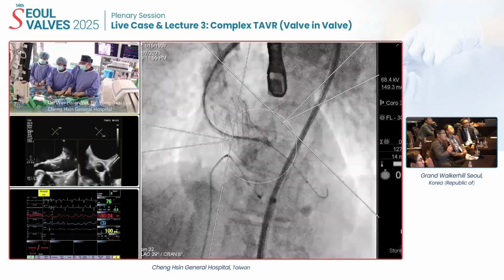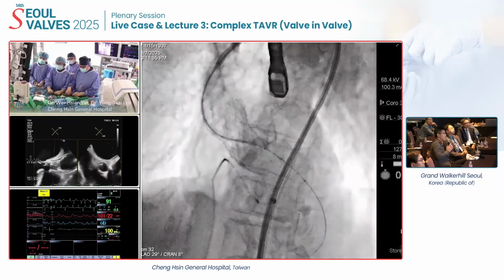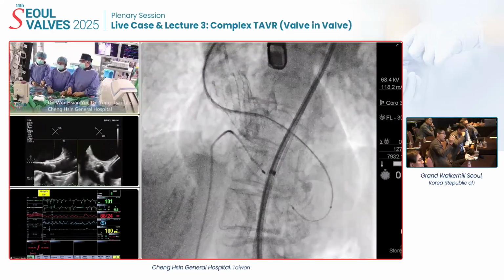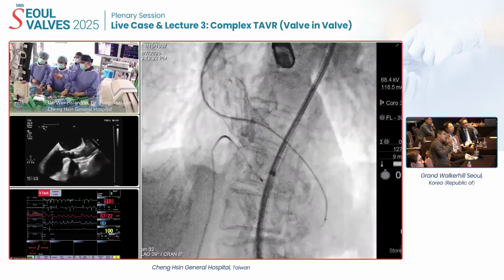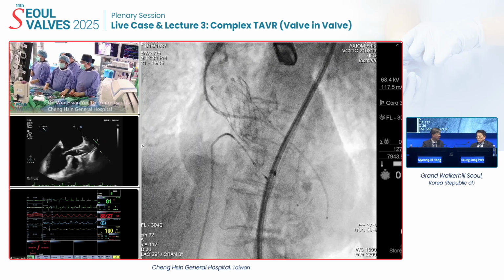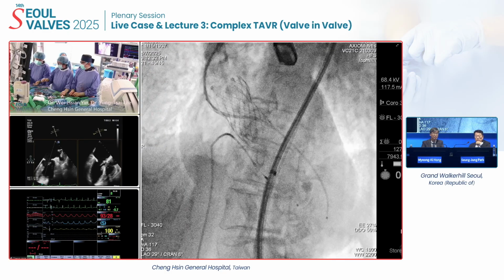So the most important part for unicorn is we do not lacerate the leaflet prior to the valve deployment, because once you've lacerated the leaflet using a balloon before the deployment, the leaflets will really be flying around and you will not be able to predict where the leaflet goes. With the leaflet integrity remaining intact prior to the deployment, that's how you really control release and lacerate the leaflet. That's the purpose.